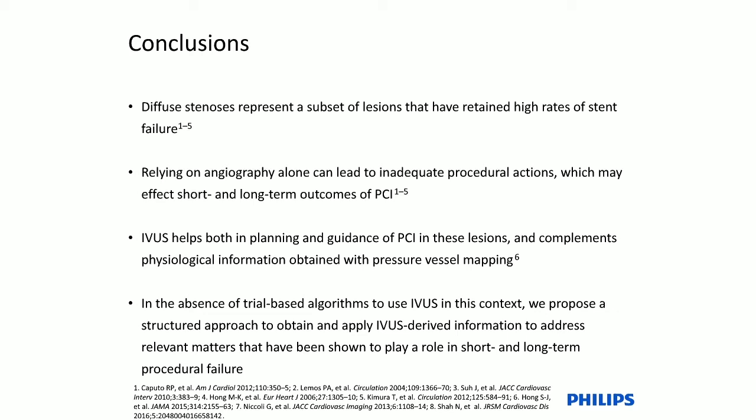I think that once you obtain the information with IVUS and you circumvent the limitations of angiography, it becomes clear to you that you have much better chances of obtaining a better optimization of your PCI than when you are using angiography alone. So with this, I will conclude my presentation, and I really look forward to your comments and discussions.